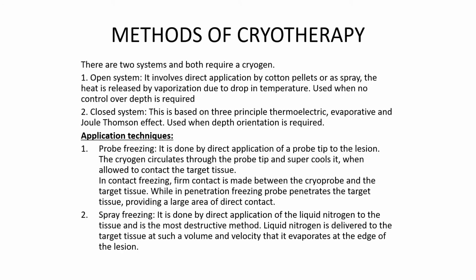عندنا spray freezing. It is done by direct application of liquid nitrogen to the tissues and is the most destructive method لأنه درجة البرودة كلش عالية تصير وسبراي يعني ينتشر بكل مكان. Liquid nitrogen is delivered to the target tissue at such a volume and velocity that it evaporates at the edge of the lesion.